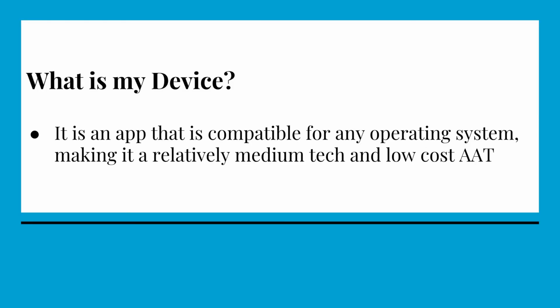And so now we can come to the actual creation of my device, what my device is, and I can tell you a little more about the idea, the process, and my vision for it. My device is an app that is compatible with any operating system, whether it's iOS or Android. You could access it on tablets or iPads or anything. So it's relatively medium tech, or maybe even low tech, but it's a low cost assistive technology.